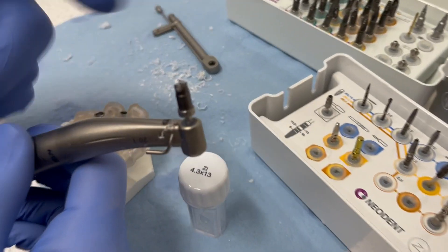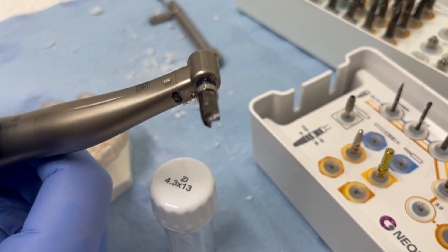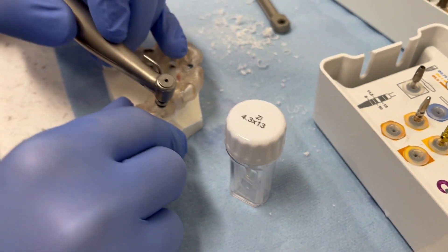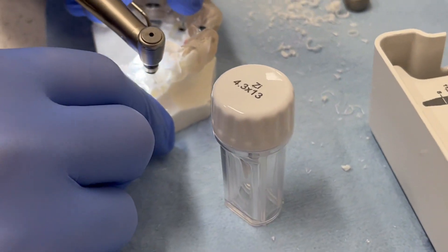Just like before, we have the same workflow. We're going to use this bone profiling or milling cutter to make room for our cylinders. And we're just going to take this down to the depth stop.